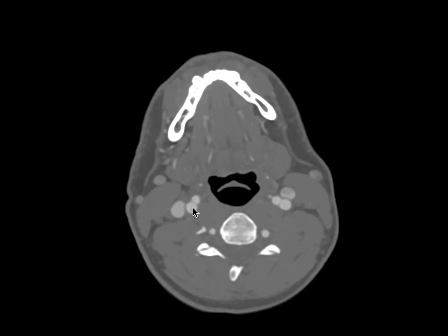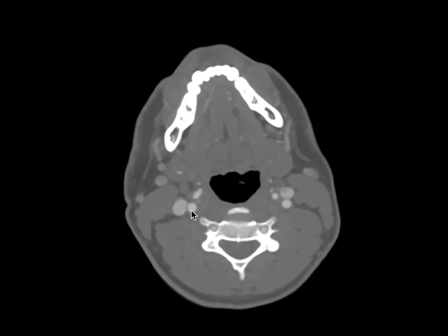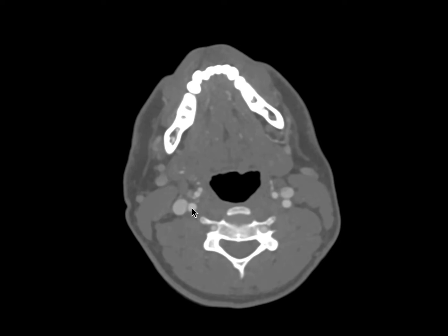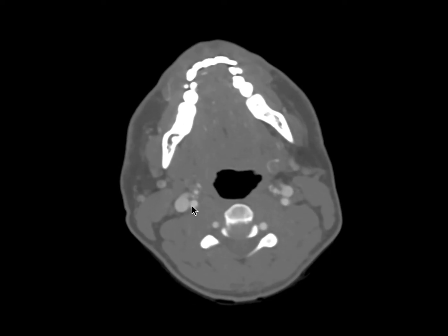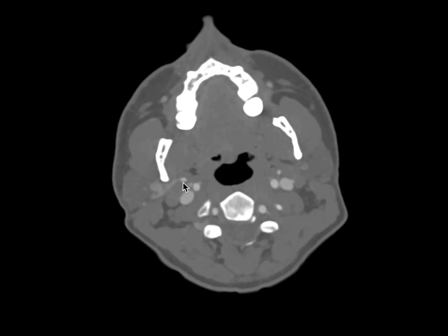This first segment is slightly dilated in its first 1 to 2 centimeters, and this is attributable to the presence of the carotid bulbs. As we continue superiorly, we'll notice that this internal carotid artery cervical segment has no branches, and that it goes from a posterolateral location relative to the external carotid artery to a more medial location further up. Here's our right external carotid artery, and here's our right internal carotid artery cervical segment now medial to it.